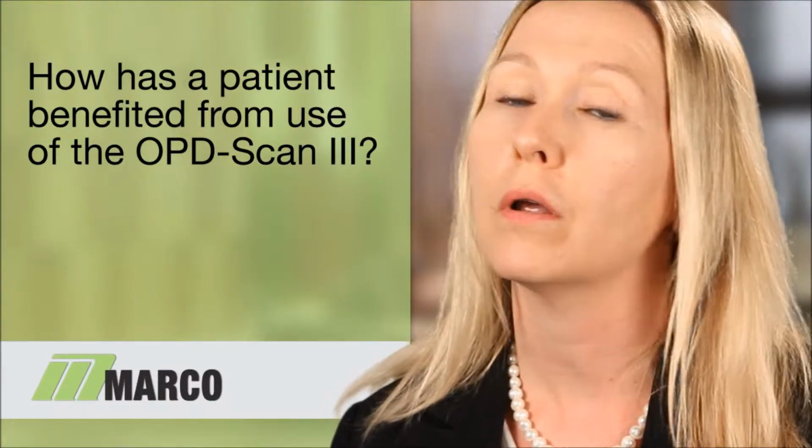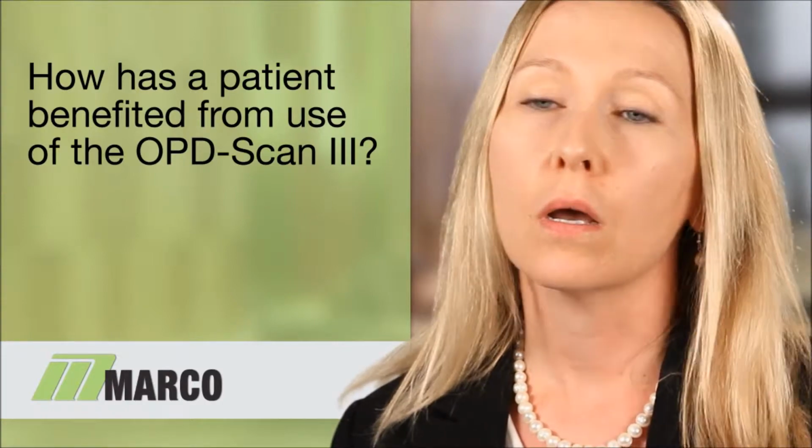We looked at the posterior chamber implant, and it was clear with a minimal posterior capsular fibrosis. And we also looked at the cornea, and everything was fine. So we went back to the OPD. We noticed his preoperative measurements were very normal. His cornea was clear.